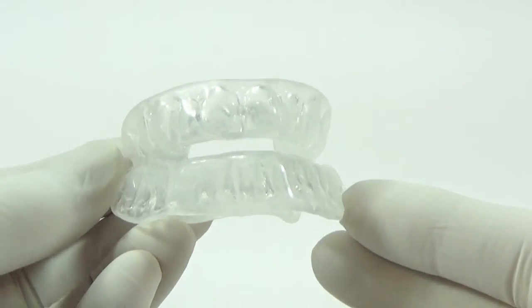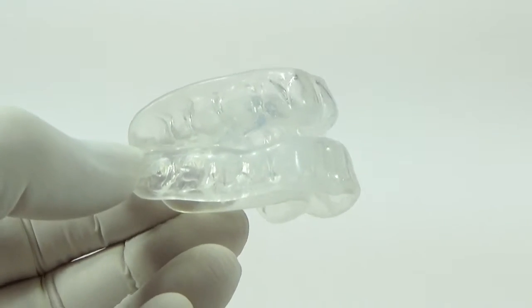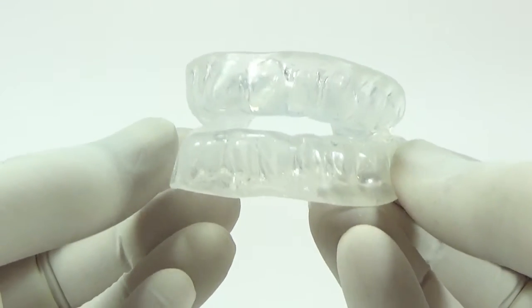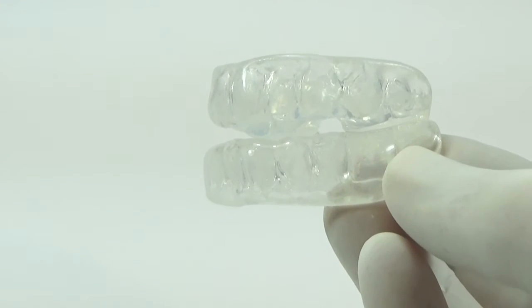Our custom device addresses all these issues by fitting your mouth perfectly. Created from dental impressions that we teach you how to take, it's perfectly designed to fit your dental profile with no dental visits and everything achieved in your own home.